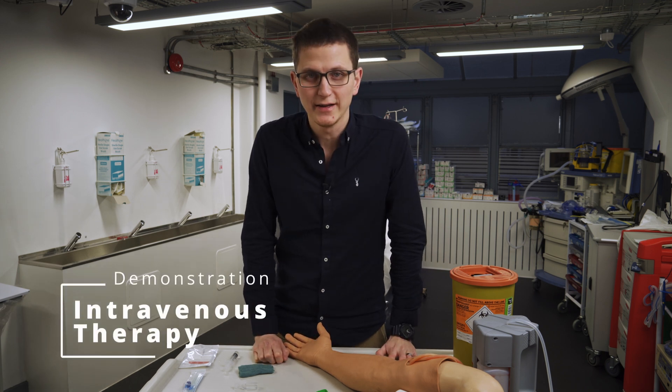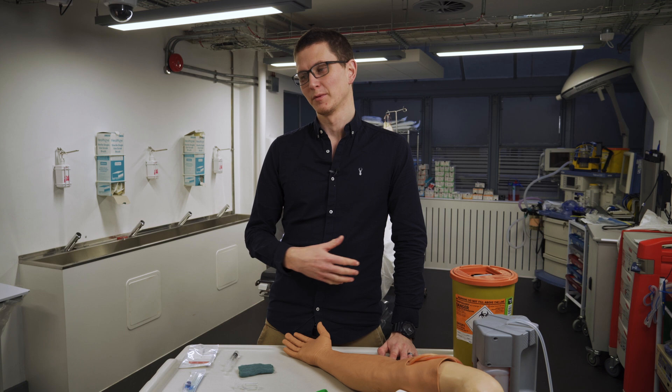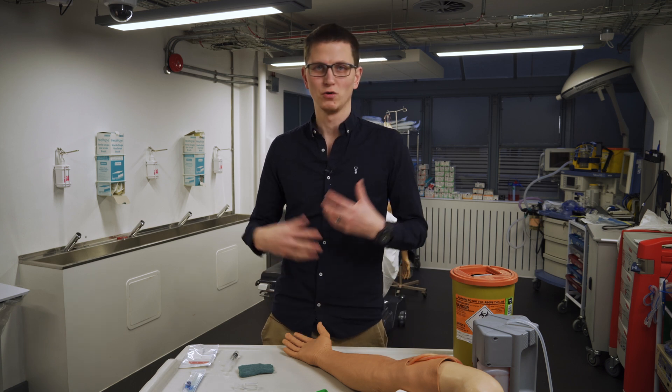Hello and welcome back. Today we're going to be doing IV lines. We're going to be talking about how to put up an IV cannula. I'm going to tell you all the tips and tricks, so if you're new to this and you're learning how to do this process, stay tuned.